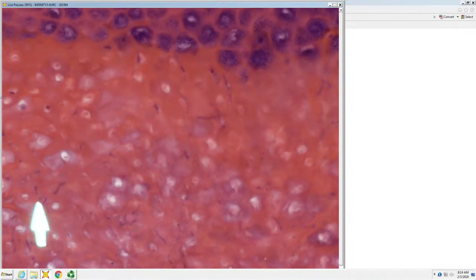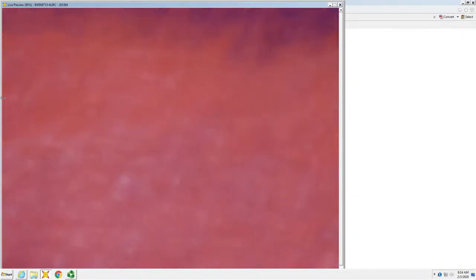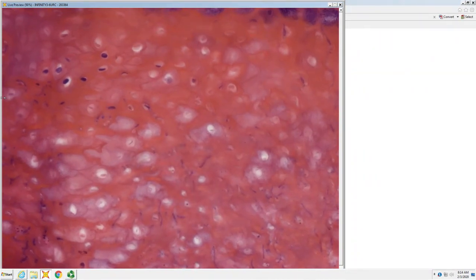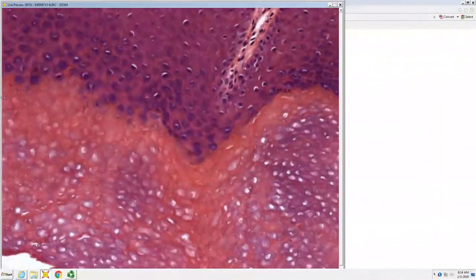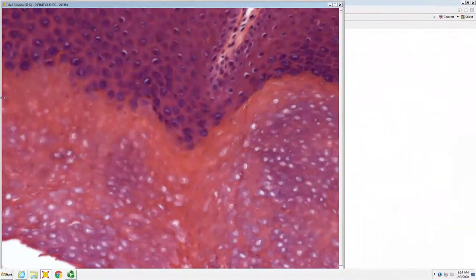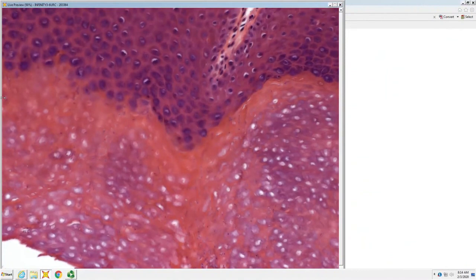These are kind of intermediate in size, but at least some of them you can see become hollow. They look like they have cytoplasm, so rather than being an erythrasma type pattern, they also go into budding forms, and they're vertically oriented. So this is all Candida, and this is a patient with Job syndrome and massive hyperkeratosis that's all candidiasis.